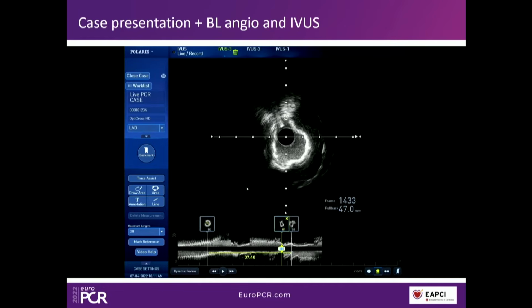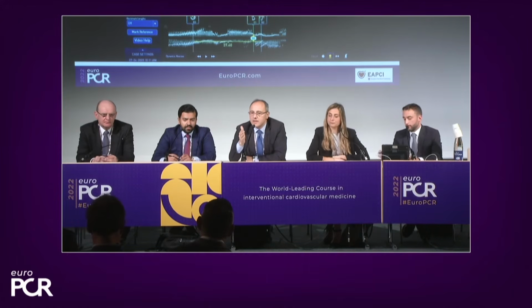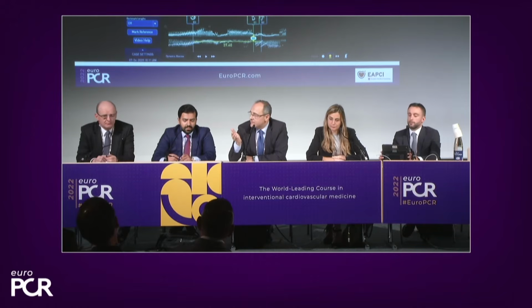If there is a low penetration of intravascular imaging, as we've heard from the previous discussion, it means that this kind of case is currently being performed under angiographic guidance. There is no other way out. And I wonder what might be the risks we are running doing this kind of procedure purely under angiographic guidance. Now we can comment on this with hindsight, knowing what's inside the vessel. So who wants to start?